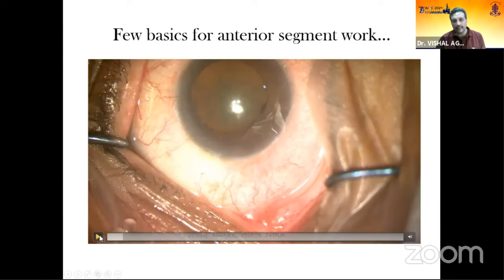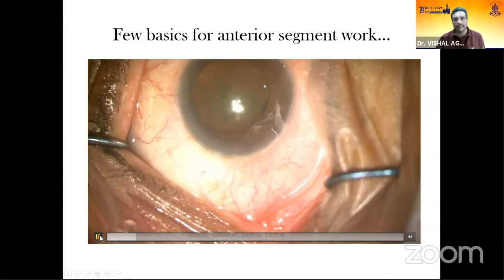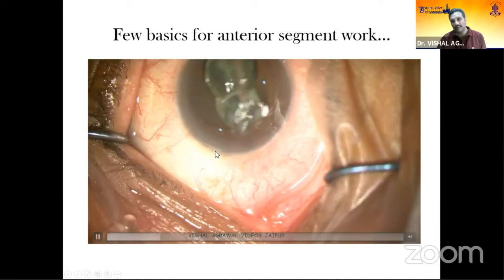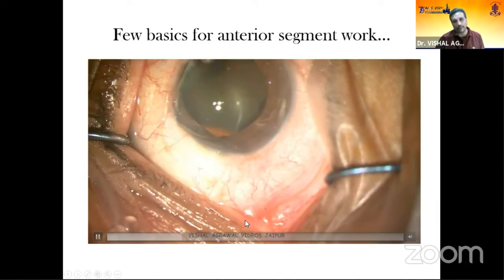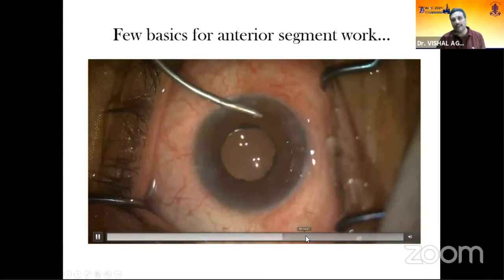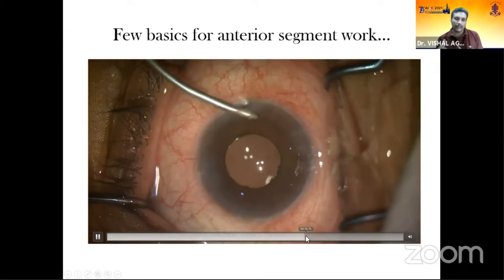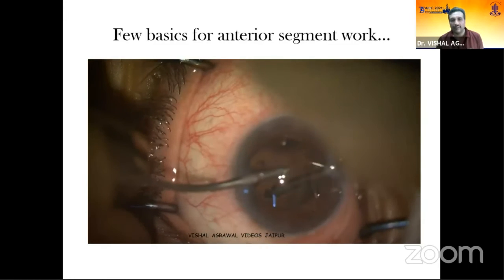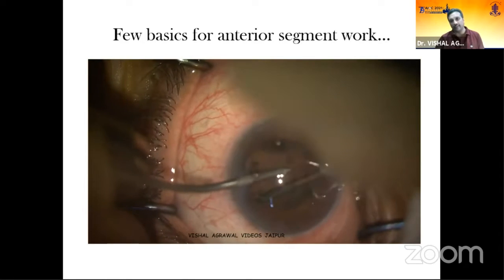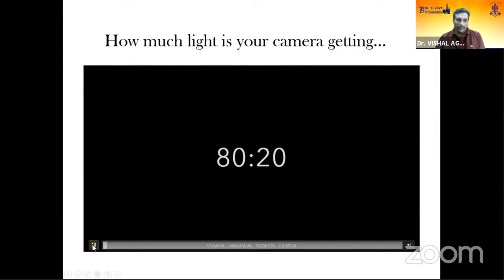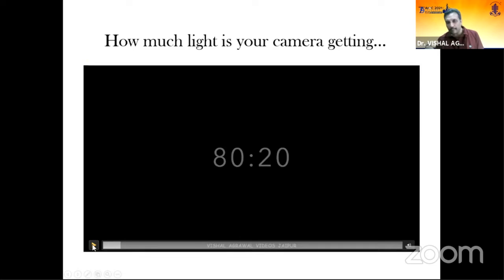Every surgeon has their own preference for illumination settings. This is not a preferred setting because all the conjunctival vessels are blooming. You have to look at the screen and adjust the brightness. This is a more natural color hue in which all the conjunctival vessels are visible.